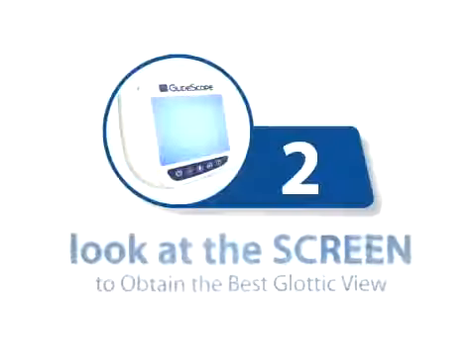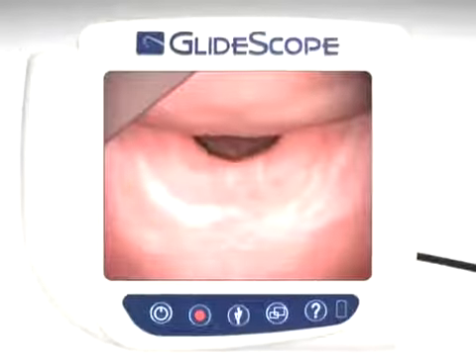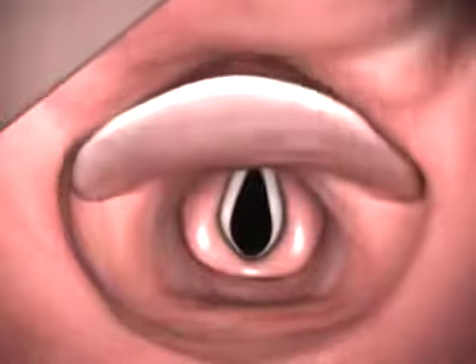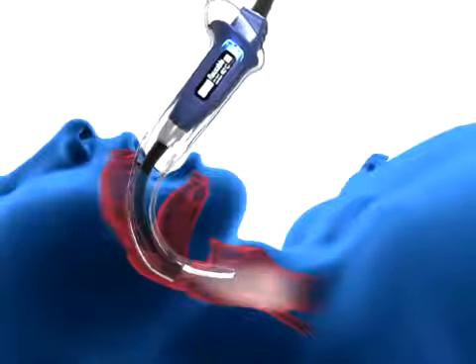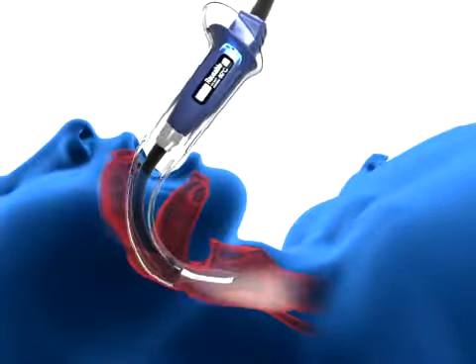Step 2 is performed while viewing the video monitor the entire time. With the GlideScope inserted, look to the monitor to identify the epiglottis. Then manipulate the scope to obtain the best glottic view. The glottic view is optimized by a combination of advancing or withdrawing the laryngoscope slightly, while increasing the tilt to seat the device in the vallecula or on the posterior surface of the epiglottis to obtain the best glottic view.